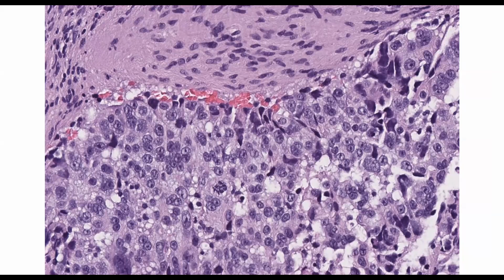That's incredibly rare. For schwannoma to progress to malignant peripheral nerve sheath tumor can happen, but it's a different animal. It's a different biology that leads to that. 99.9% of the time, it's neurofibromas that progress to MPNSTs. Is there a variant of schwannoma? Is this an epithelioid schwannoma? Oh, I'm not really comfortable with that. I don't know if you see my cursor here, but essentially what I'm highlighting is a mitotic figure. It looks ugly. Okay, well, let's do some immunostains.